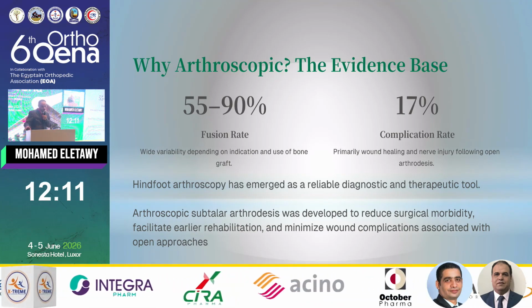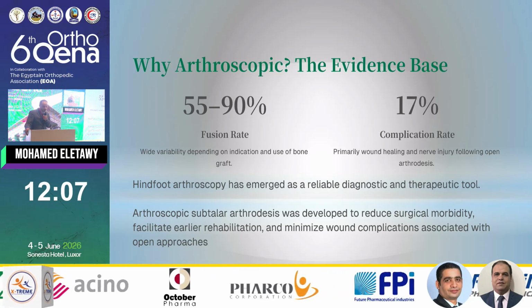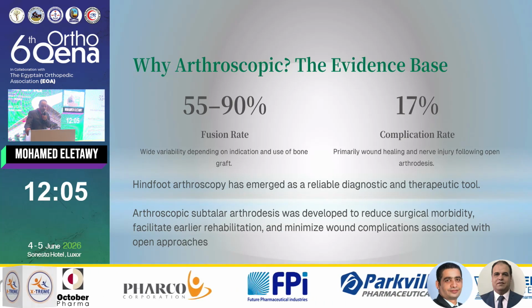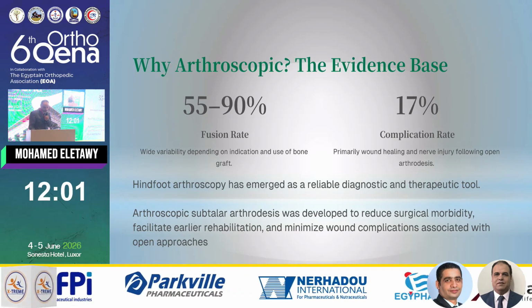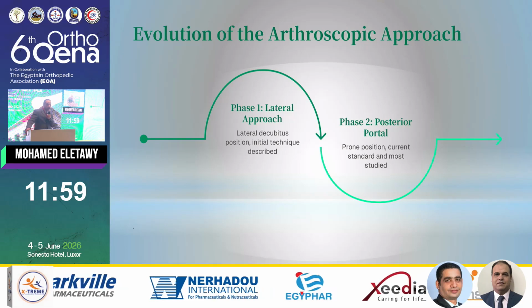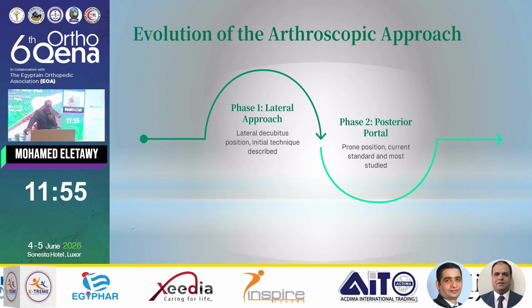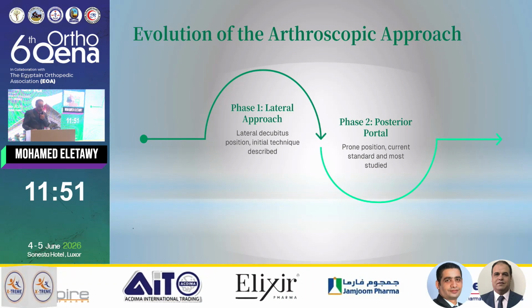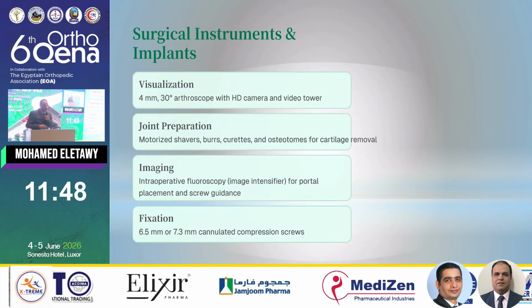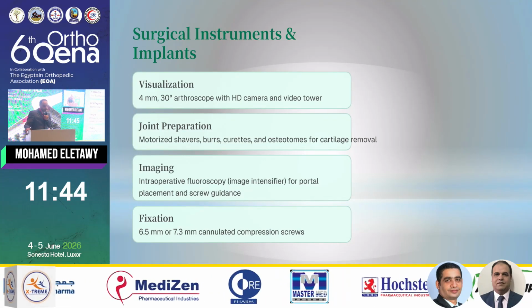Arthroscopic subtalar arthrodesis was developed to reduce surgical morbidity, facilitate earlier rehabilitation, and minimize wound complications associated with open arthrodesis. In phase 1, it was the lateral approach, but nowadays we go to phase 2, the posterior approach, when the patient lies in prone position.